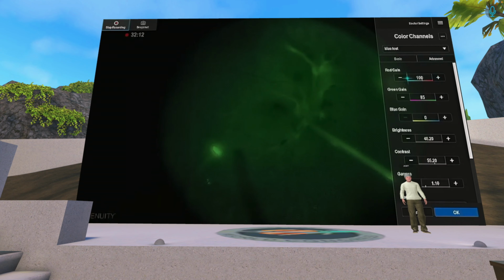And then, Lukan, you mentioned the xenon light source being a little better on the Constellation you have. The menu has the Constellation light, I'm blanking on one other, and then the xenon light. Do you have that on the xenon light? Yes, all my sources are xenon light with exciter filter.